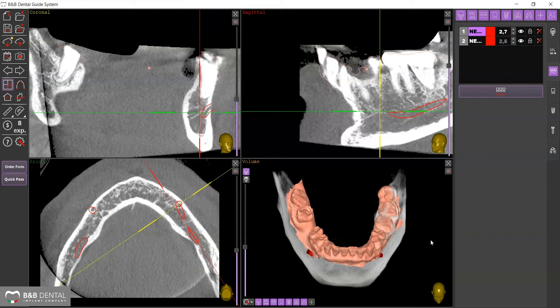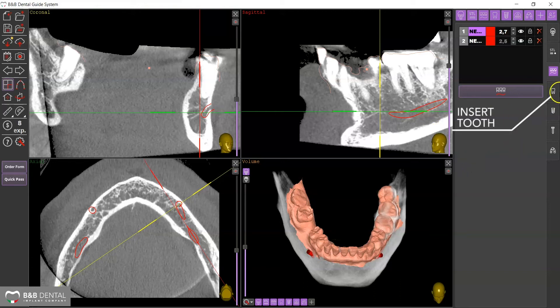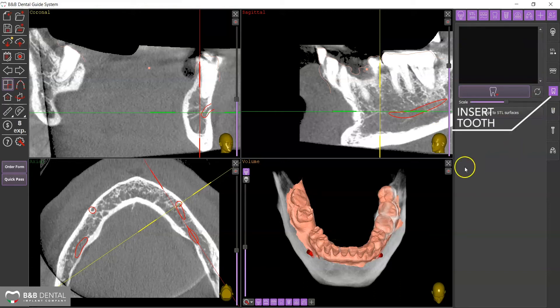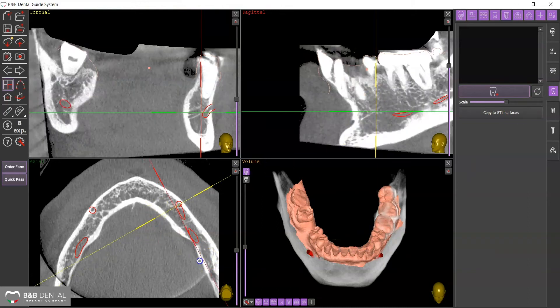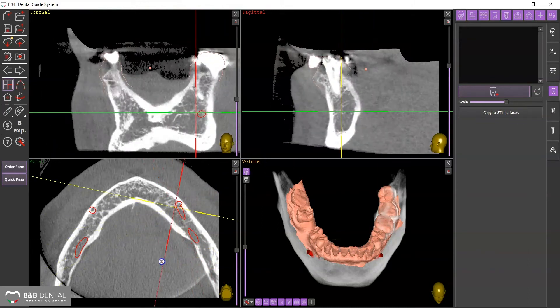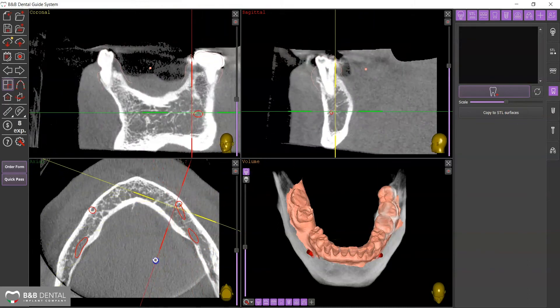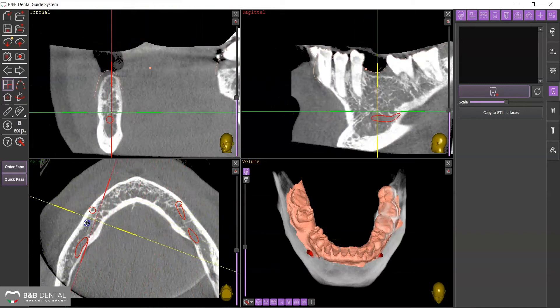Select the Insert Tooth tab from the right panel. The insertion of a tooth in the correct prosthetic position can help in the correct positioning of the implant and the choice of the appropriate abutment.